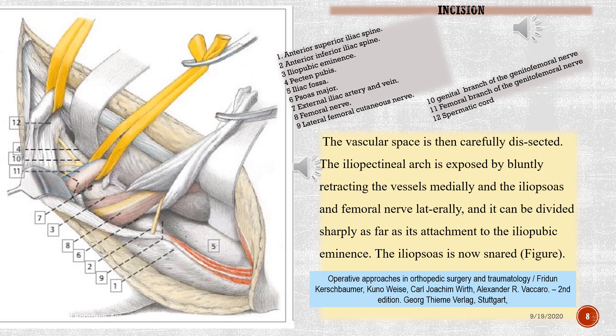Anatomical structures identified: 1. anterior superior iliac spine, 2. anterior inferior iliac spine, 3. iliopubic eminence, 4. pecten pubis, 5. iliac fossa, 6. psoas major, 7. external iliac artery and vein, 8. femoral nerve, 9. lateral femoral cutaneous nerve, 10. genital branch of the genitofemoral nerve, 11. femoral branch of the genitofemoral nerve, 12. spermatic cord.